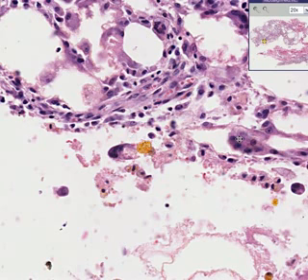So here is a giant cell. These are generally foreign body granulomas here. You can see a variety of inflammatory cells, chiefly macrophages and lymphocytes, but I'm sure you could find a neutrophil, which this probably is. And you can see some hemosiderin, or extensive hemosiderin, within macrophages too. Classic appearance for fat necrosis.